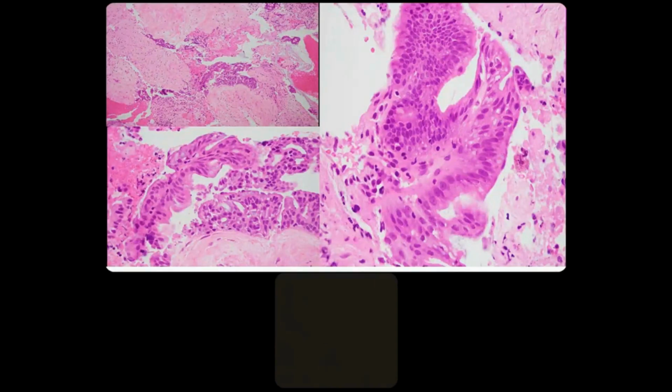Okay, more tissue here. Again, lots of stroma, lots of blood, bit of mucin, and then some epithelial elements entrapped here, and here it is under high magnification. Well-formed papillary structures, clearly mucin-producing glands, nuclear atypia, bit of hyperchromasia, nucleoli, pseudostratification, low-grade dysplastic features.